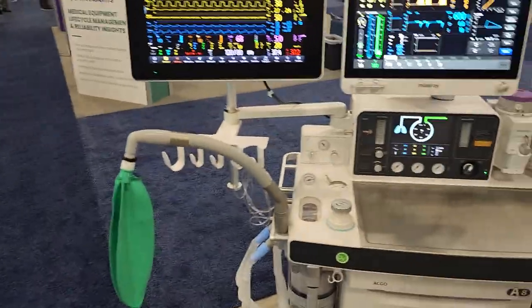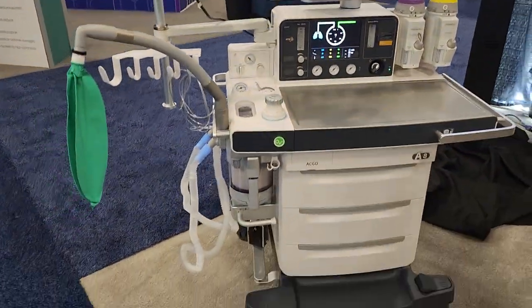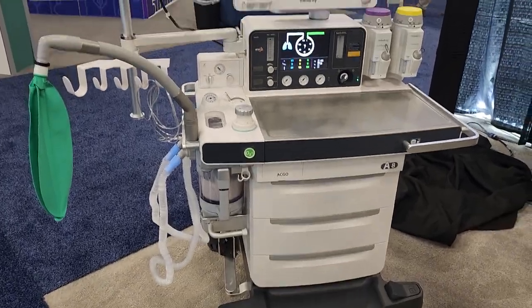Hey guys, I just stopped off at the Mindray booth and there's a couple new things that I want to talk about — some very good design choices and a new anesthesia machine that I've never seen. Let's go ahead and take a look really quick at these devices.